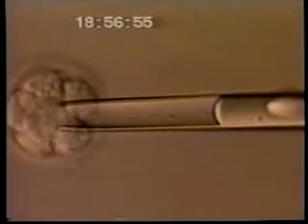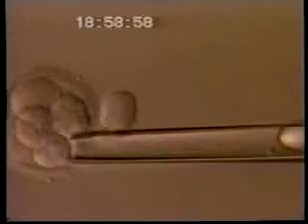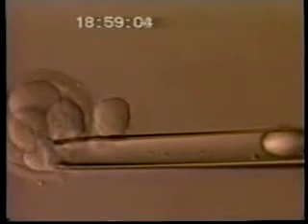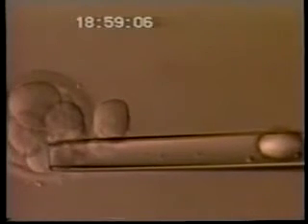Now we're putting a much larger pipette through the hole that was created by the smaller drilling pipette, and we're going to decide which one of these blastomeres can be most likely gently teased out without damaging the rest of the cells of the embryo. We're in the process now of trying to gently pull this cell out through some of the fragmented areas and through the hole in the zona pellucida without damaging either this cell or any of its surrounding cells. That biopsy looked relatively easy because the cell was not very tightly attached to its other components in the embryo.